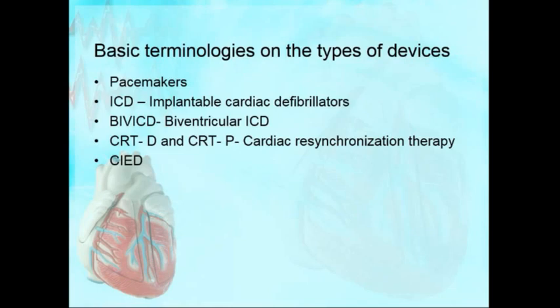Now, that is ICD. The next platform in the devices is called BiV ICD. This is where, again, it is very commonly misunderstood among multiple practicing internists I know who are in the field of hospitalists, and they would not understand the difference between BiV and a dual. So BiV ICD means you're actually having resynchronization of the ventricle with two leads, one in the right ventricular apex, one on the outside of the left ventricle, but you're trying to synchronize the heart.